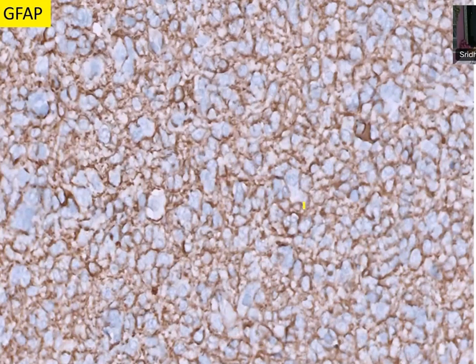This is GFAP. How do you want to evaluate? GFAP is coming out positive in the background. The fibrillary processes are positive for GFAP. It is very boxcar-like; you can see all the cell membrane is nicely positive. There are no processes you are seeing. If GFAP is positive, what do you want to call?